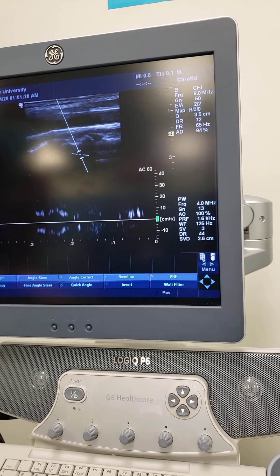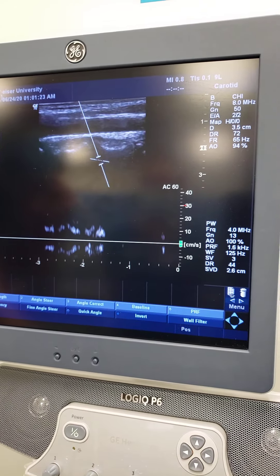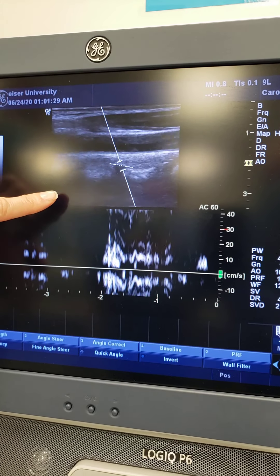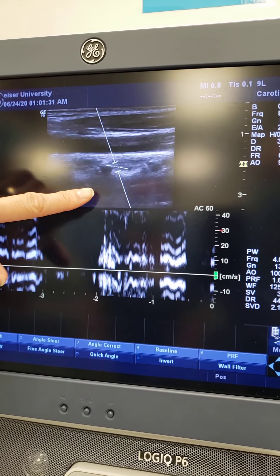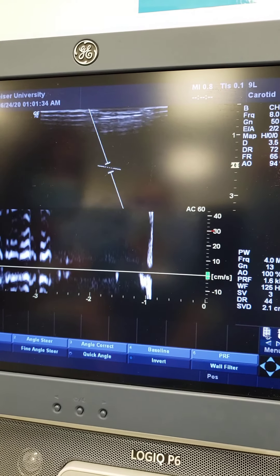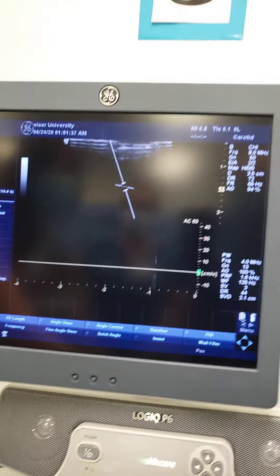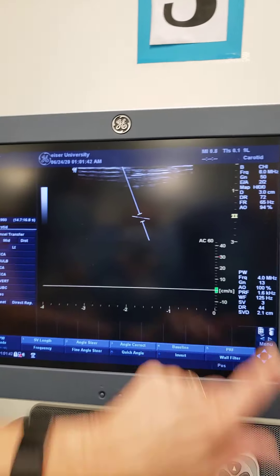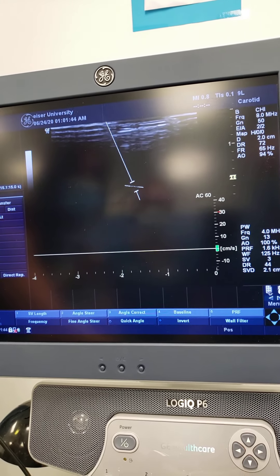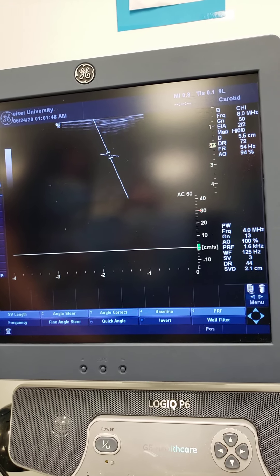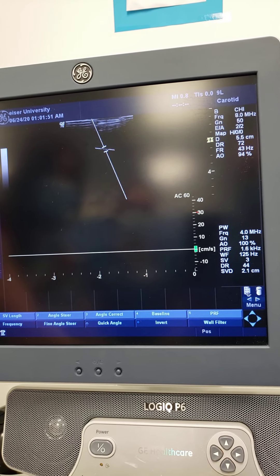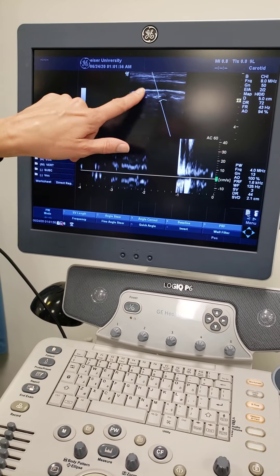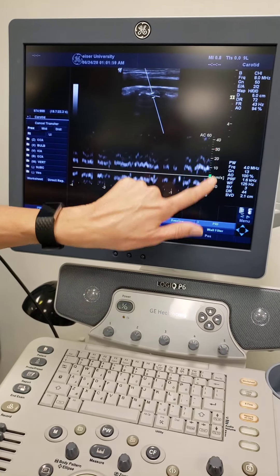See, this is the vessel. See how my depth is really deep? Remember we were talking about the PRF? Do I need to be that deep? No. Why would I want to decrease the depth? Now the depth here is three centimeters — see how I'm changing that? I'm going up and down with the depth button, which is right here on the control. So let's look at this vessel. It's pretty shallow, right? I don't need all this wasted space. I need more PRF for my velocity scale.